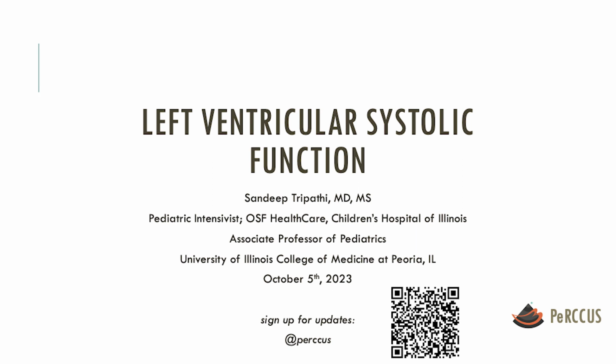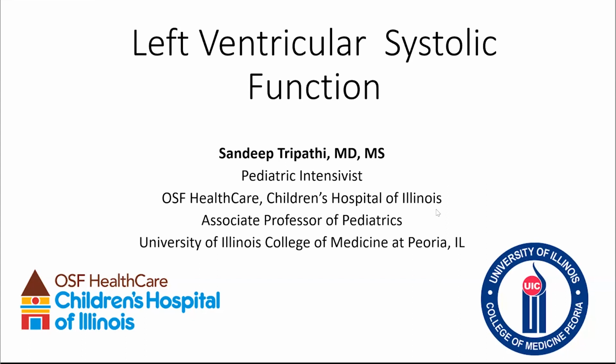Left ventricular systolic function is probably one of the more important things that we do as an intensivist in the ICU. I don't have data to back it up, but I think after vascular access and maybe volume assessment, function assessment is probably something that we do most frequently. So it's good to know all the ways that we can assess it and what the barriers and pitfalls are.